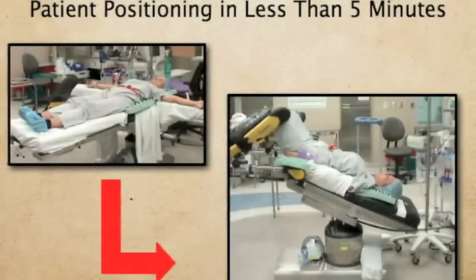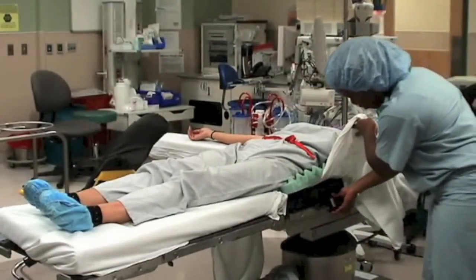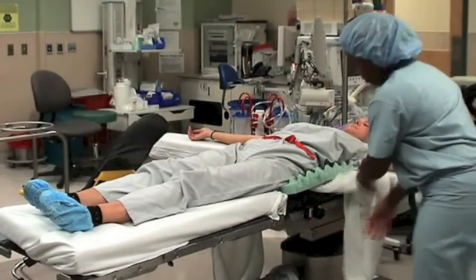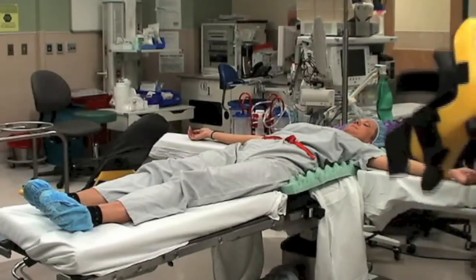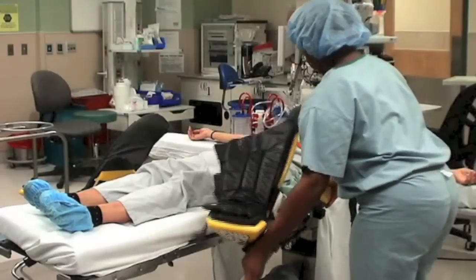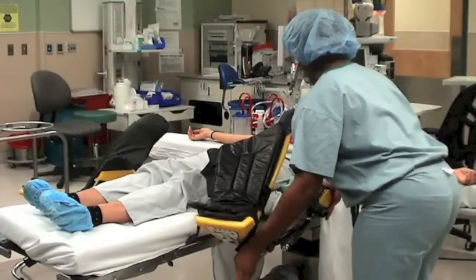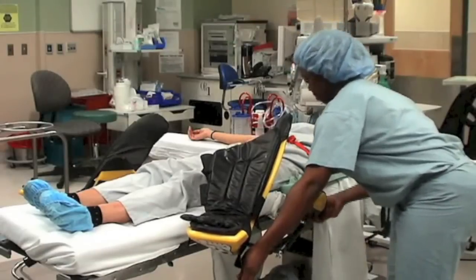Safe patient positioning can be performed in less than 5 minutes. Safe patient positioning can be performed efficiently and does not have to be a lengthy process. Here, we demonstrate an unedited positioning of a patient from the supine position to the lithotomy with Trendelenburg position. This process takes approximately 4 minutes.